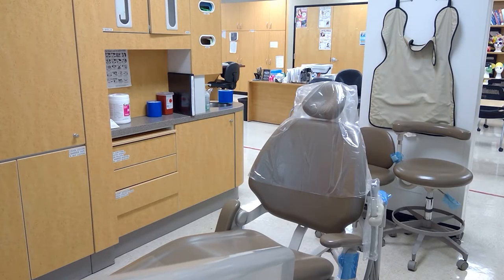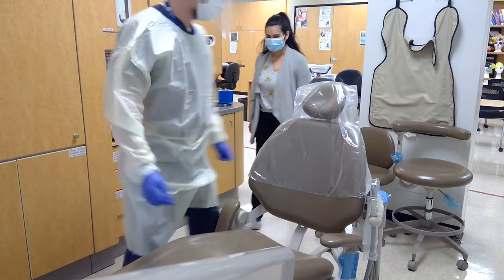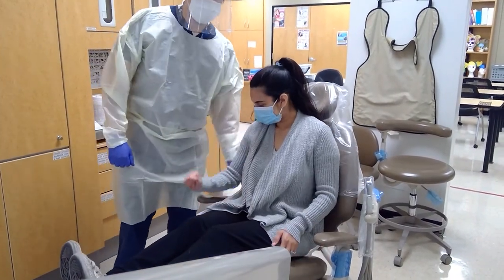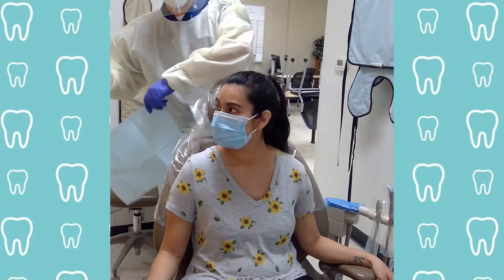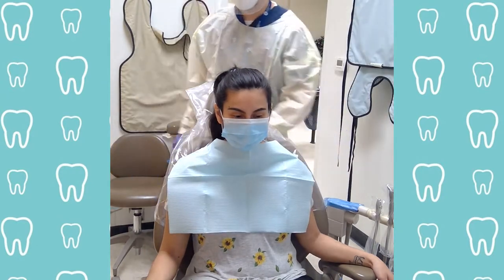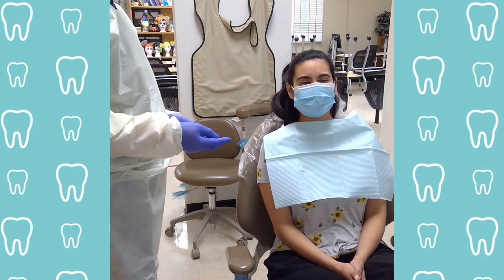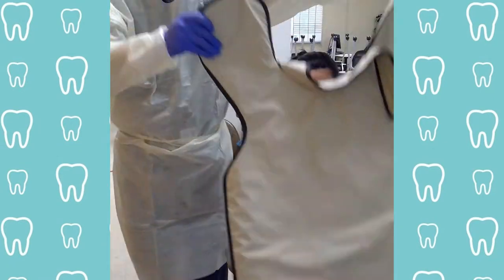Bring your patient in. Be sure to guide and navigate them to the chair and watch as they get in in case of any falls. Bring the armrest up to secure them. Begin by placing their patient bib over them. During this time be sure to ask any important questions — allergies, pregnant, anything that may affect our process.